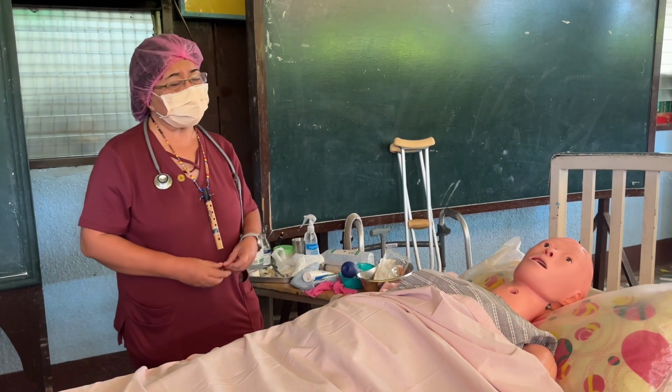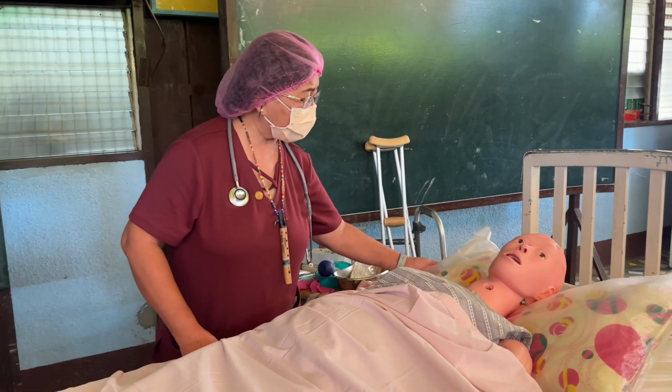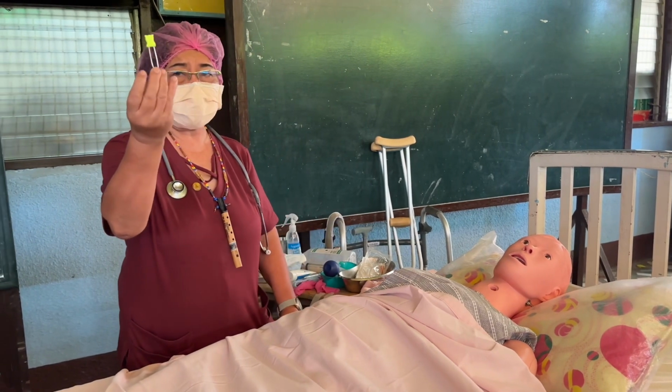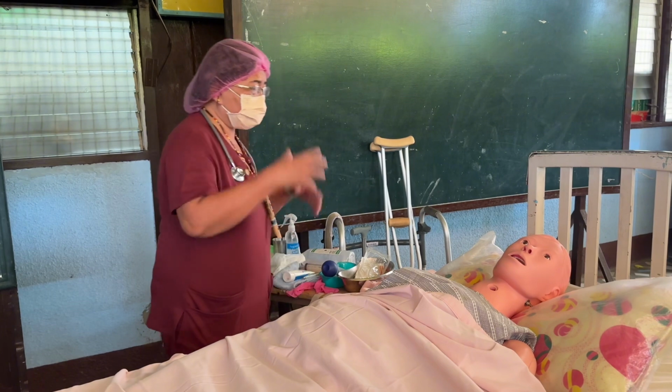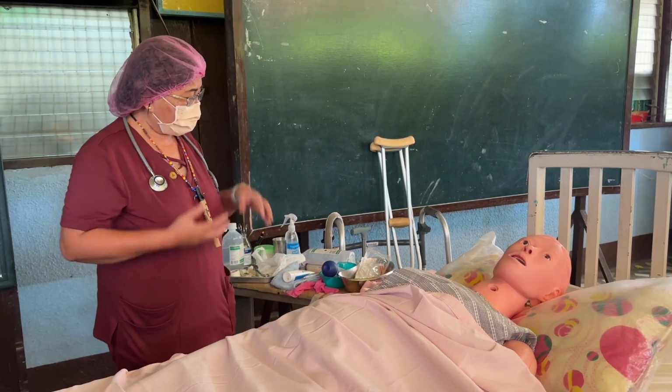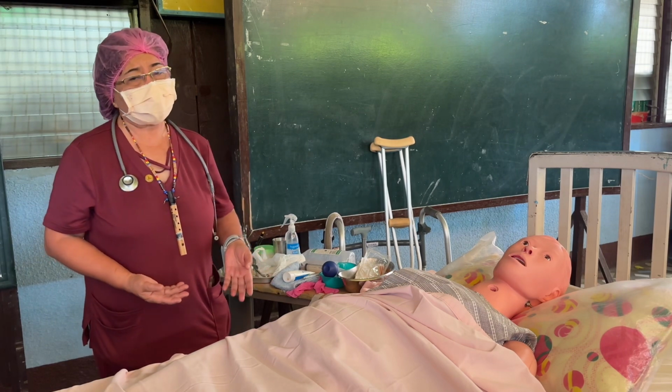After insertion, some just tuck the tube under the pillow. Others will make use of a safety pin for easy mobility of the tube. Of course, you should wear complete PPE, mask and gloves. The procedure is only clean.